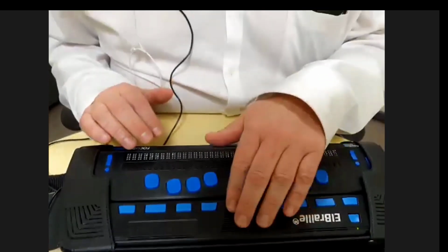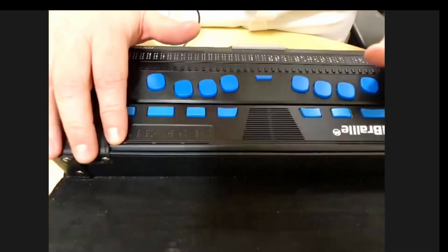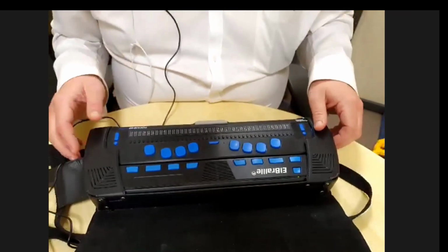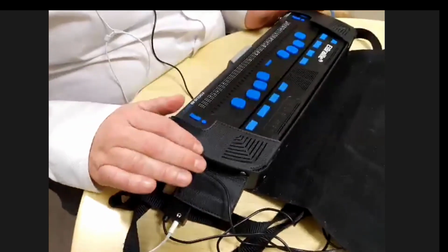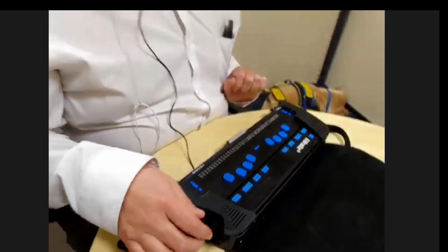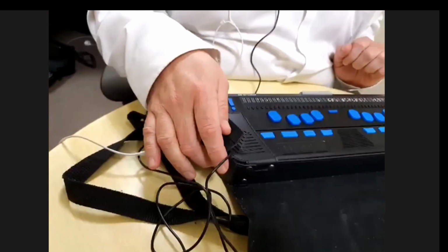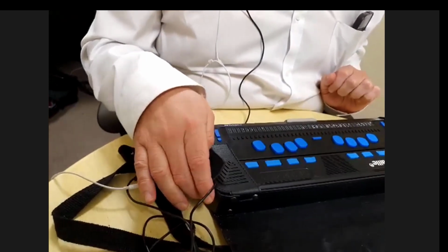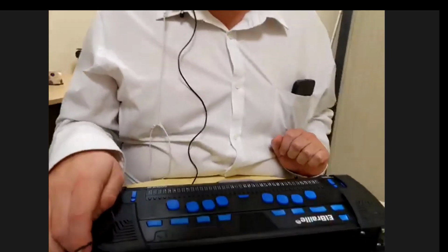Behind that, we have a fan vent and a couple of speakers, one in each of the rear corners of the device. On the right-hand side, we have 2 USB-A ports for plugging in things like USB sticks and so on, and a USB-C port, which is used for either charging the device, or you can connect another laptop via USB-C so that you can use the Focus 40 without undocking it from the Elbraille.